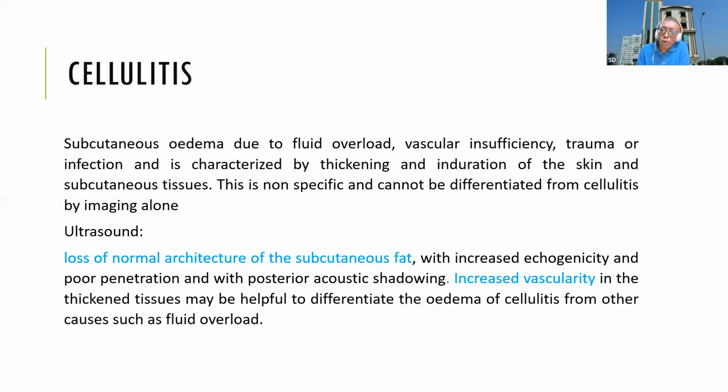So systemic and local examination will also help you in diagnosis. But with ultrasound you can also confirm the diagnosis of cellulitis by putting the probe where there is swelling, redness or edema. If you see an increase in the thickness of the soft tissue, and if you turn on the color Doppler there is lightening up of the color Doppler, then it can be a sign of cellulitis of the foot.